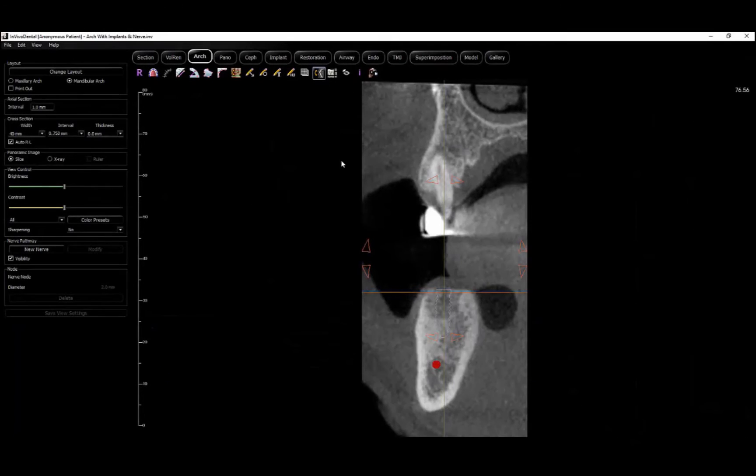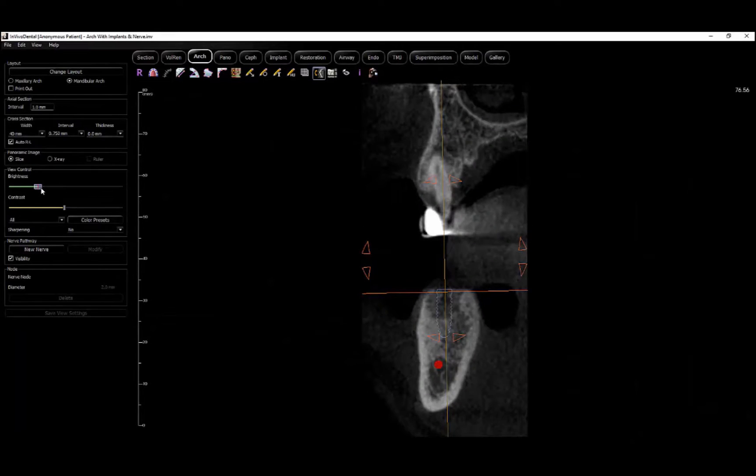Using these customized cross sections, we can make measurements with the tools in the toolbar, such as precisely determining the distance from the implant to the nerve.